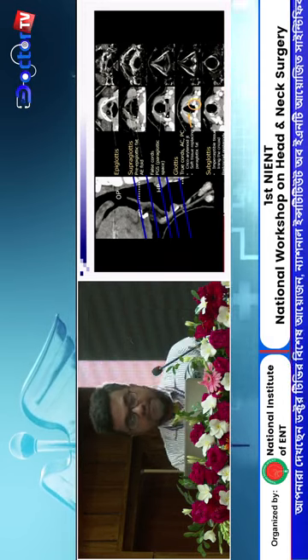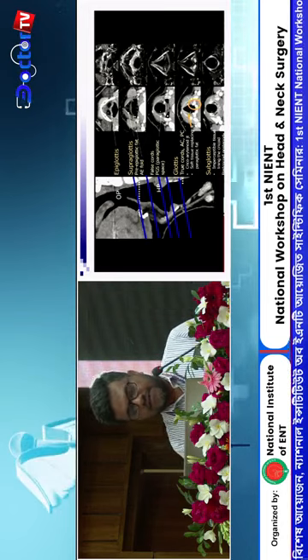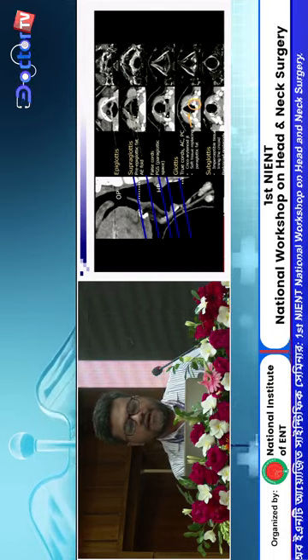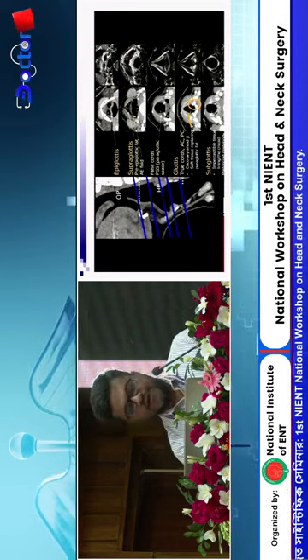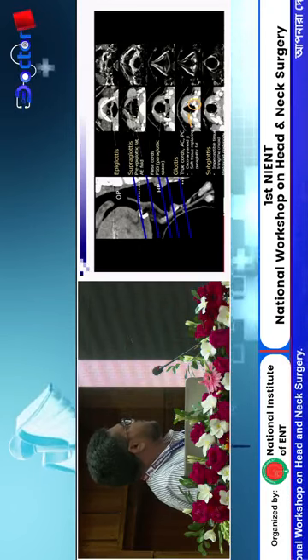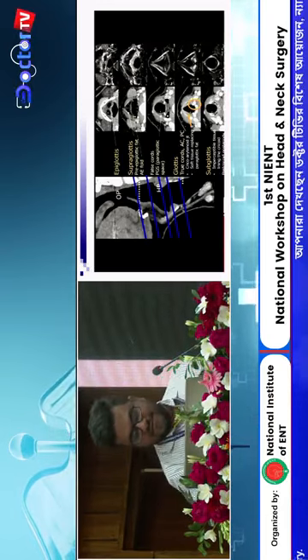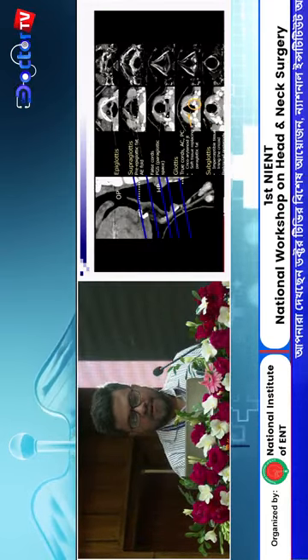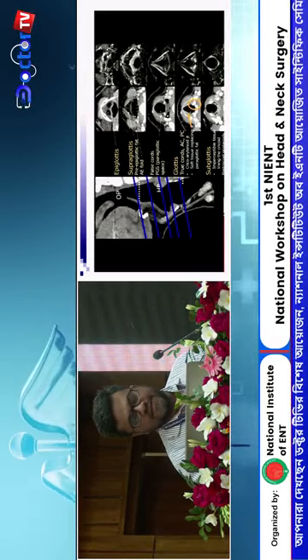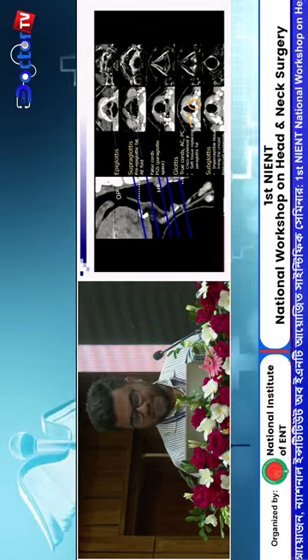Then at the level of the glottis, how do we identify glottic areas in CT scan? First, we see this circle area. This is the joint of cartilage. This is cricoid and arytenoid: the cricoarytenoid joint. Here is the cricoarytenoid joint. When the cricoarytenoid joint appears in CT scan, it is the glottic area. Below this area, when the thyroid gland appears and there is a semicircular or circular cartilaginous ring, this is the subglottic area axially.